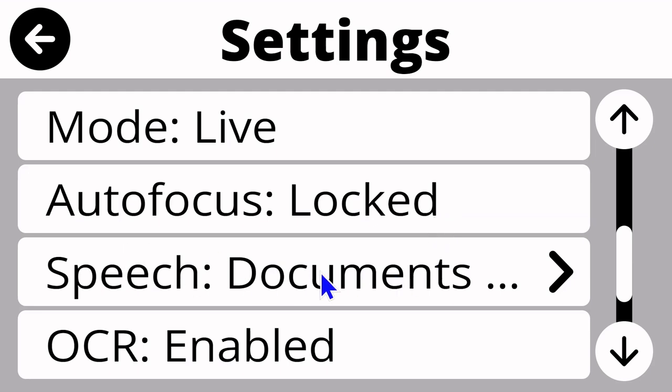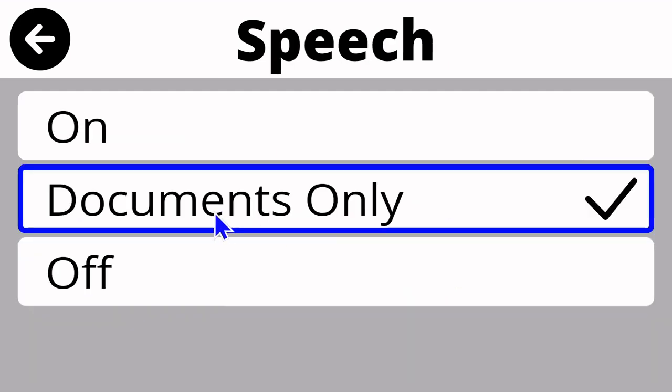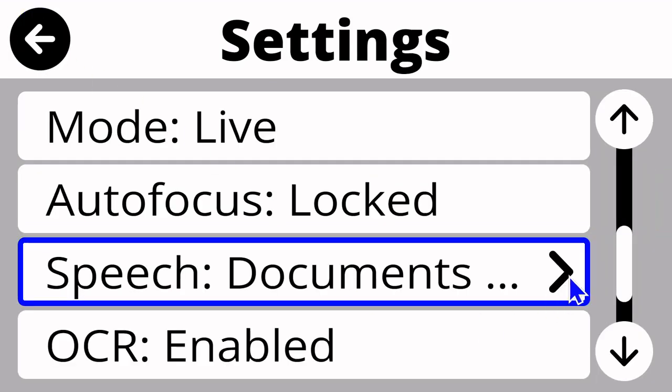Next is my speech. I have it enabled for documents only. So again, just Speech to menu, remind you, 3 items. Documents only is turned on, checked. But we could have it on all the time and we could turn it off completely. I'm going to leave it on documents only for now.